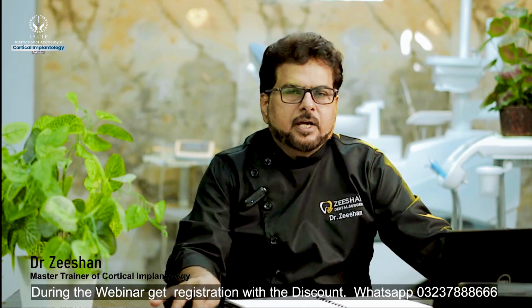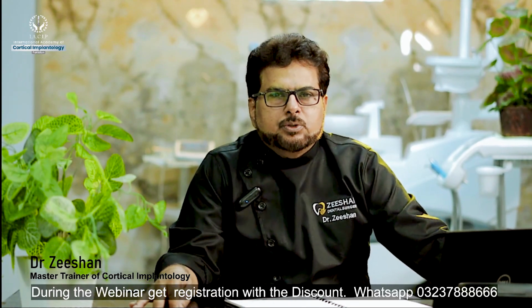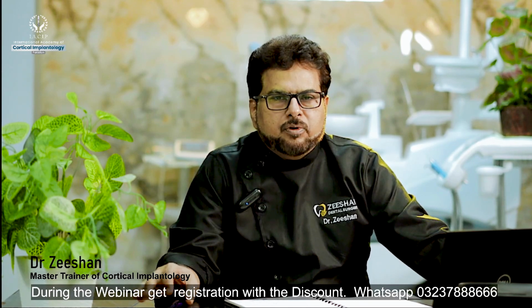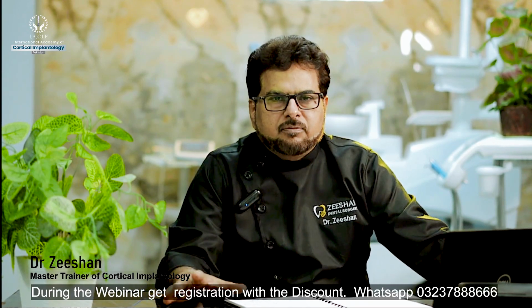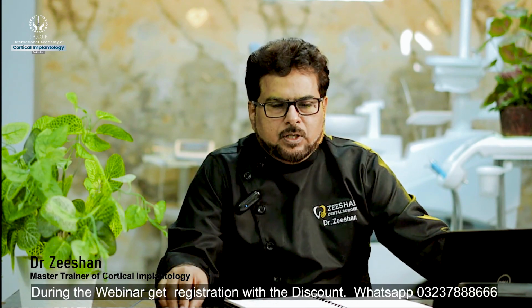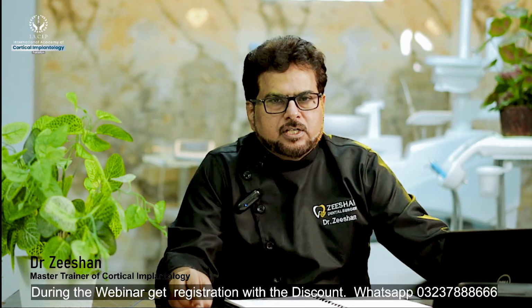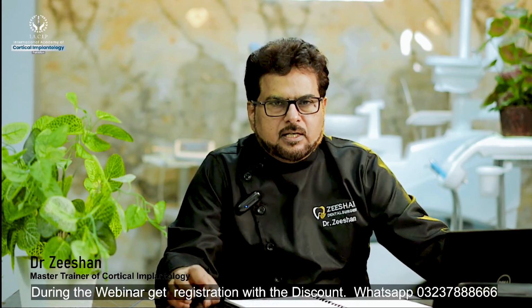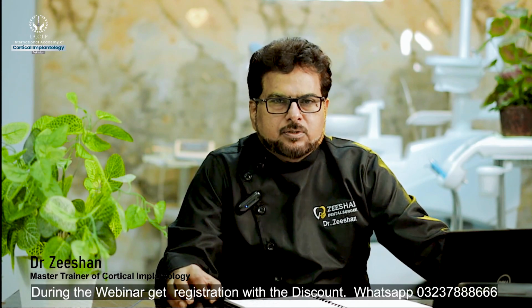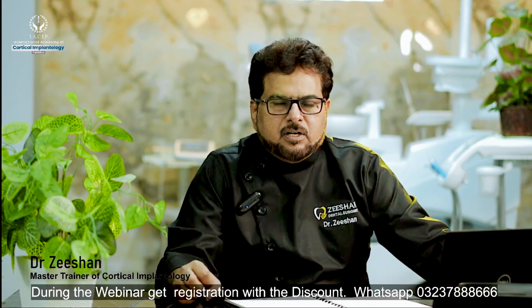So the system which we are going to discuss today is based on using the basal bone. The basal bone remains in our life forever. It doesn't resorb. One of the best things about it is that it stays solid, highly mineralized, and provides us real good strength for placing our implant.